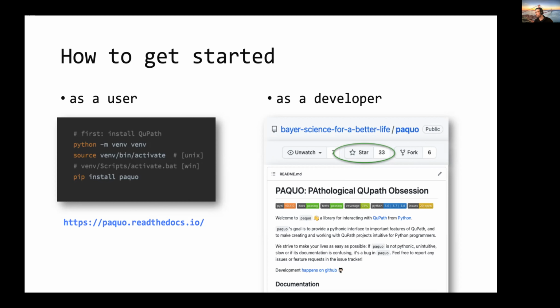Yeah. We also have a second question from Rita Sarkis. Is the training or annotation only performed in Python and then imported into QuPath, or can these be performed in QuPath as well? So currently, the only thing we abstracted is reading and writing these annotations and detection objects back and forth between projects. So what we do right now is we create predictions outside of QuPath and then write them back into QuPath projects if we want to show them to our pathologists.